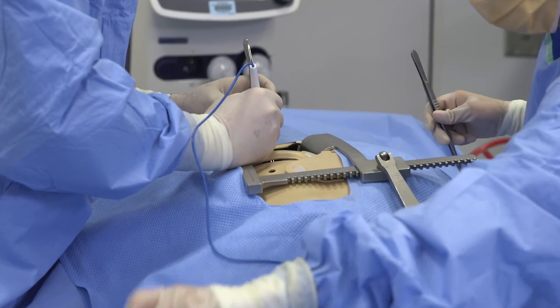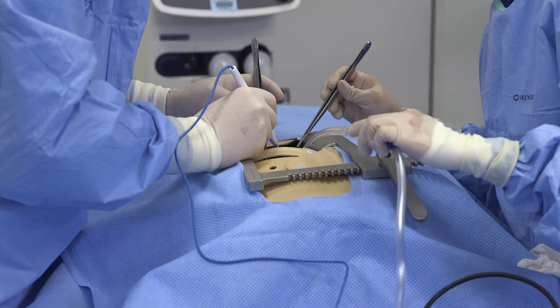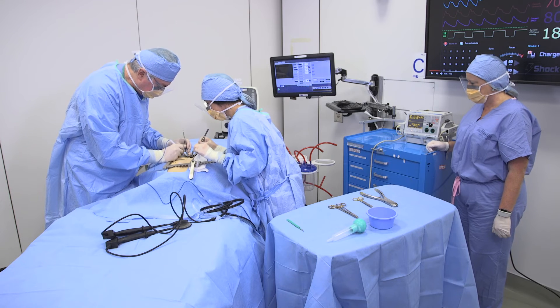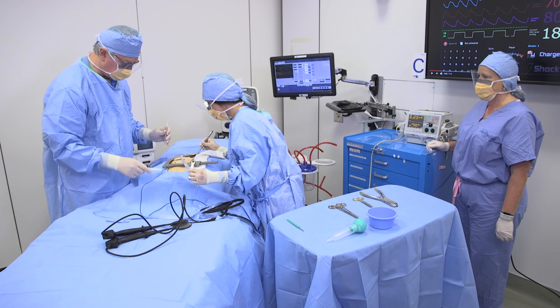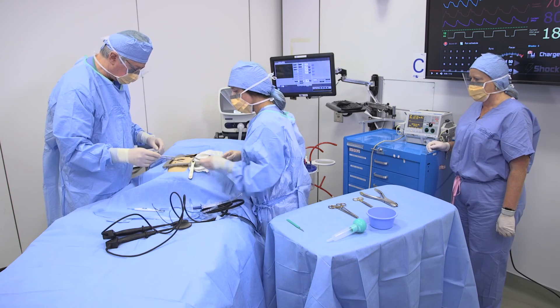Electrocautery may be used to control any oozing or bleeding. Be prepared to fluid resuscitate and give blood products as indicated during the procedure. This may require the use of a rapid infuser. Once the patient is stabilized, he will be taken to the OR for further surgical intervention.